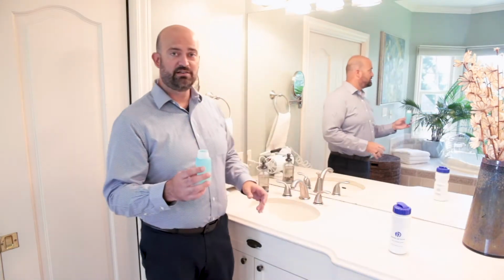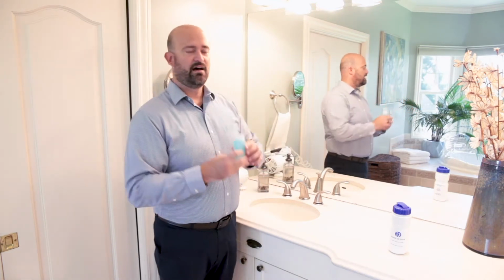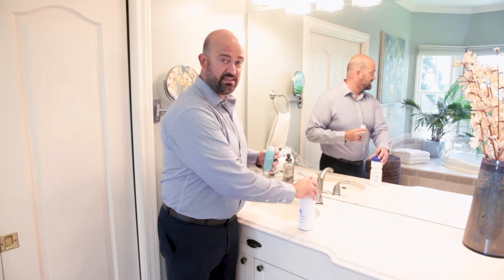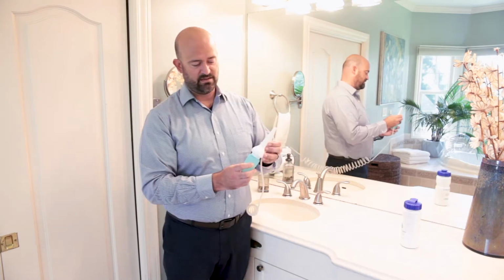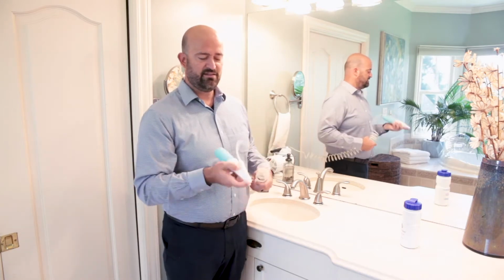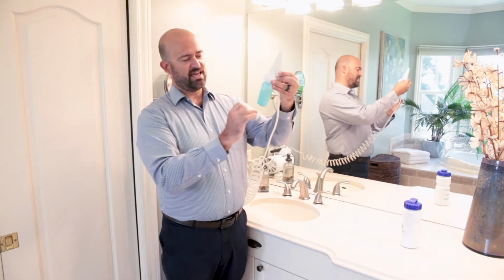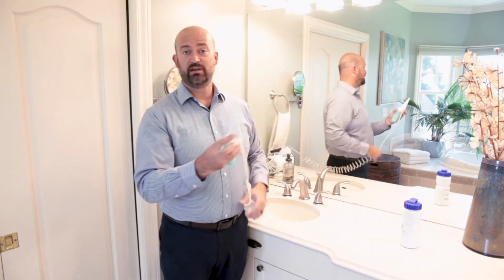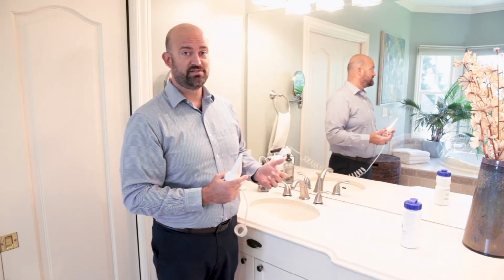The first thing that we're going to do is fill the mixer up about halfway with a little bit of water. Next, we're going to take the dental cleaning agent about an additional quarter of the way. We then attach the Jetstream tool tip to the mixer and give it a nice shake. Once we see that it is gone from just along the bottom to mix throughout, we know it's ready. Now we can go ahead and start using it.